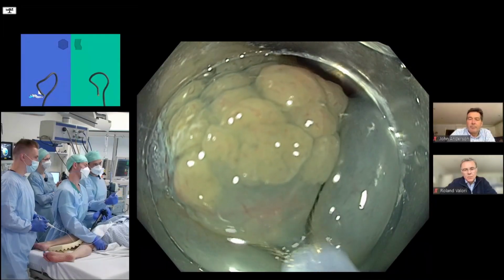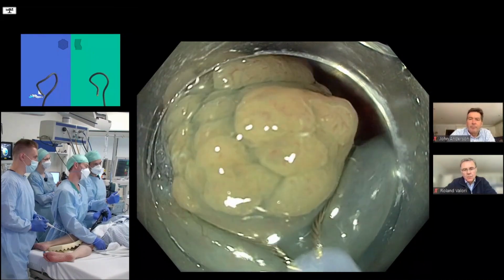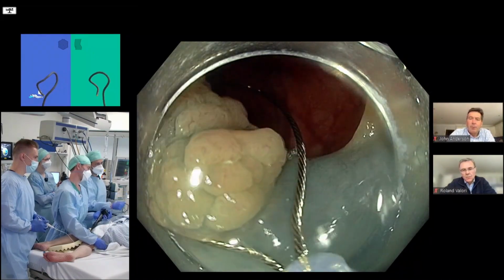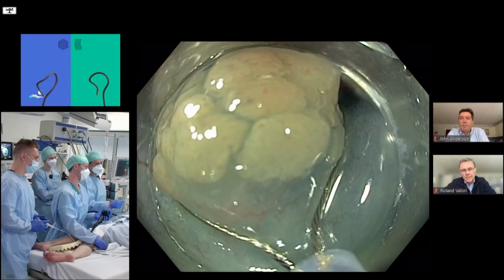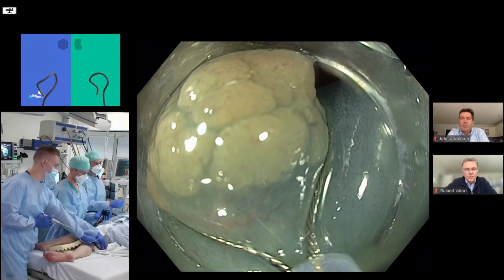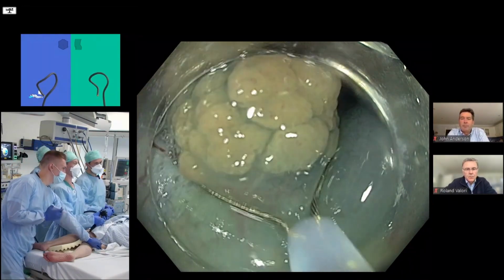And it's torque, usually, that's the key. Look at that. Yes, exactly. Yeah. Just a little bit, pull back a tiny bit. Yes, perfect. Right. Keep it there. Do you need holding to keep it there, or is it going to be good? Maybe a little bit of holding. Just, yeah. Okay, it's almost perfect.